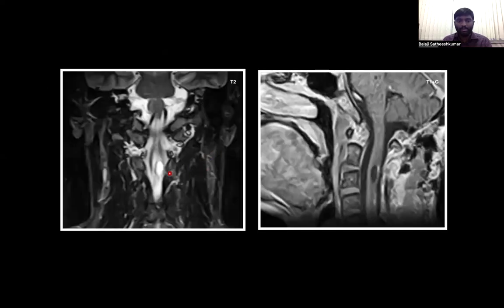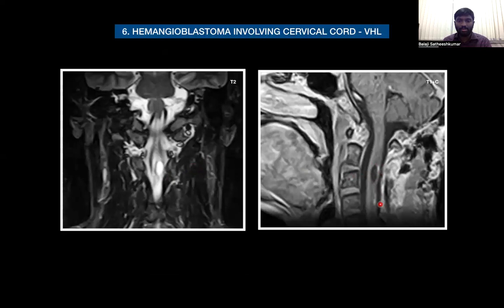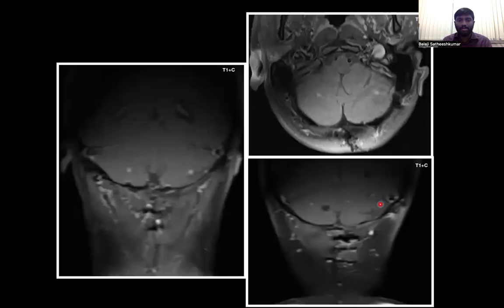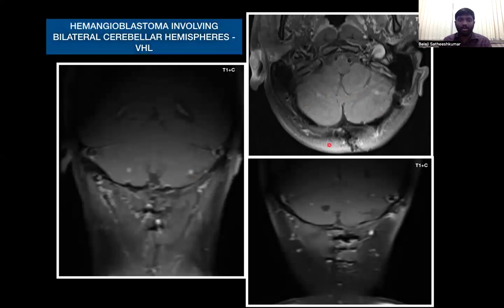The next case: here we see a cystic lesion with a mural enhancing nodule in the upper half of the spinal cord in the cervical region, and also two hyper-enhancing nodules just below the cystic lesion, suggestive of a hemangioblastoma involving the spinal cord in a case of Von Hippel-Lindau syndrome. The same patient also showed bilateral cerebellar hyper-enhancing foci consistent with cerebellar hemangioblastoma in Von Hippel-Lindau syndrome.